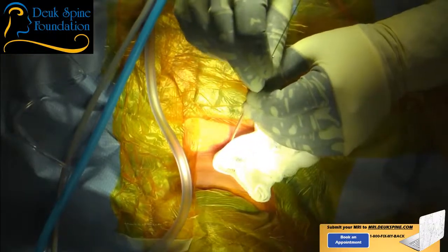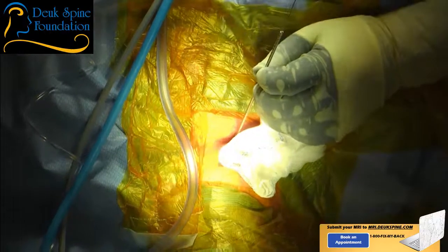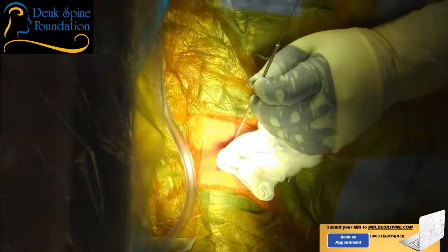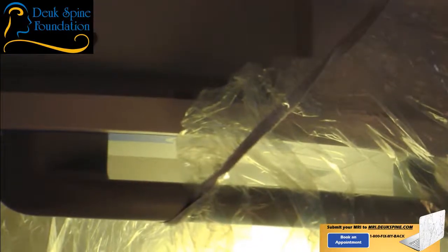Okay, shot, that's perfect. That's beautiful, go with an AP. So we got 2, 3, 4, 5, 6. We're right at the anterior longitudinal ligament in the front of the spine, I've got it. And just take your time and give me a good shot. All right, beautiful. Look where the tip of that dilator is.